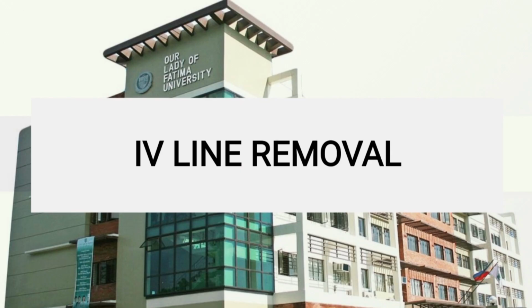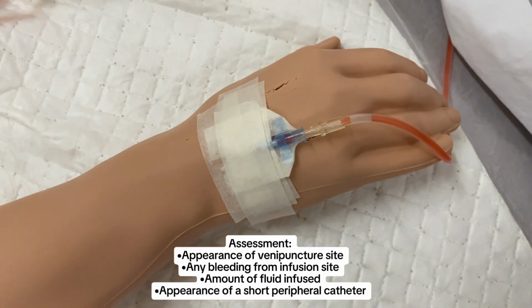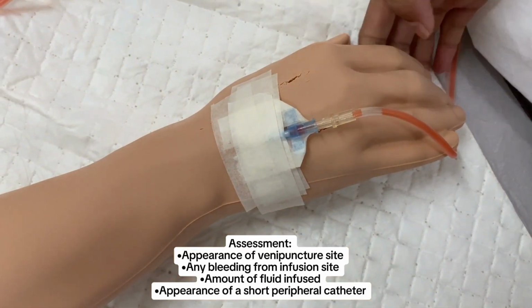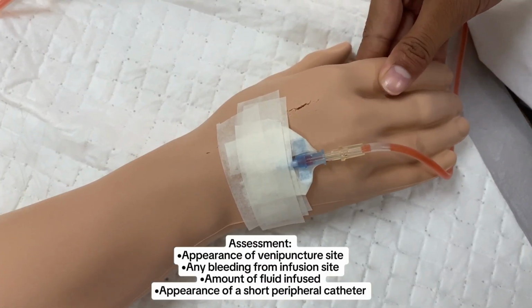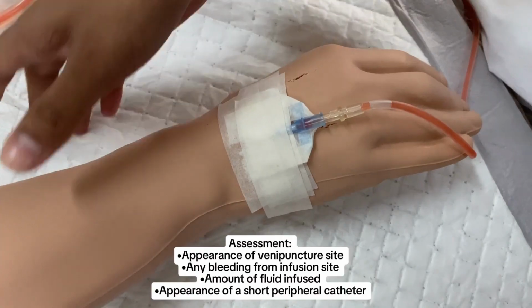Last is the demonstration of IV line removal. First, assess the appearance of the venipuncture site, any bleeding from the infusion site, the amount of fluid infused, and the appearance of a short peripheral catheter.